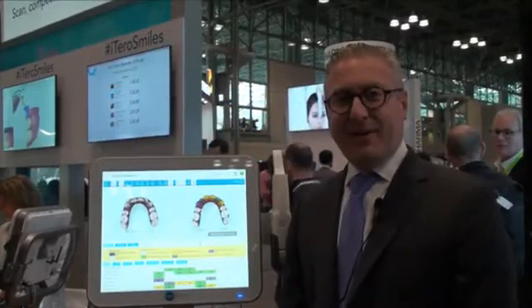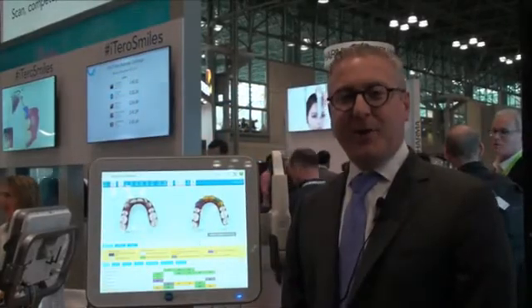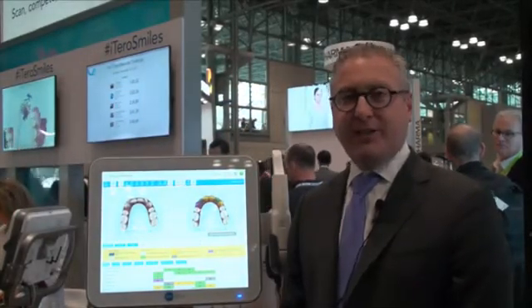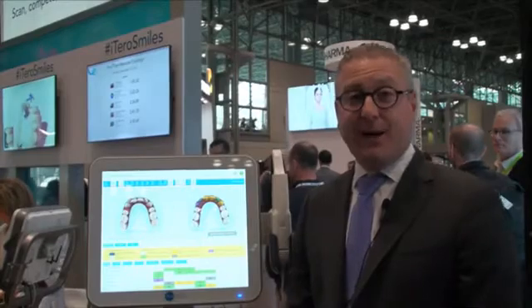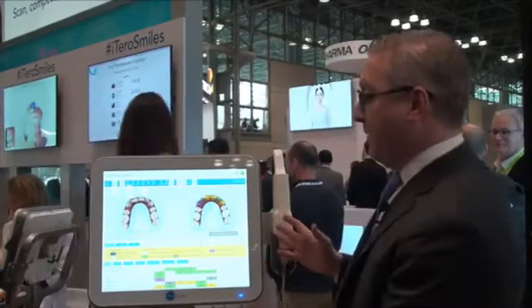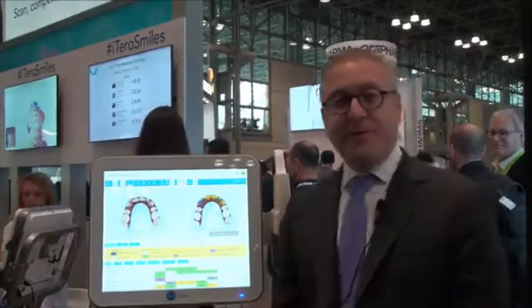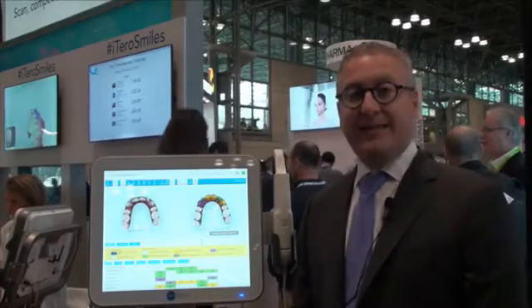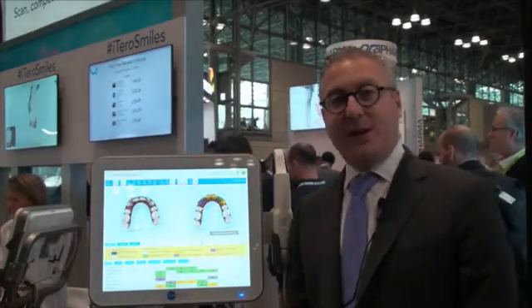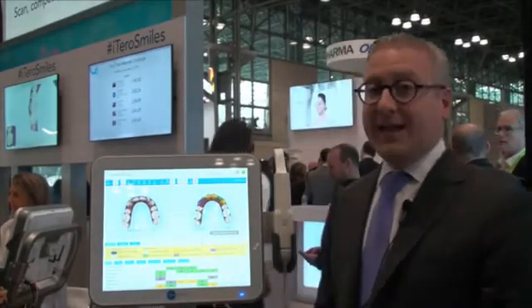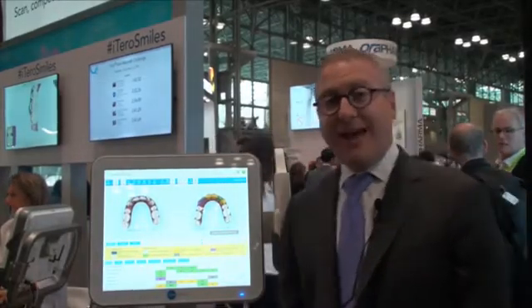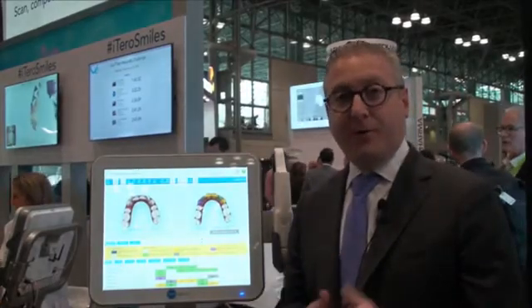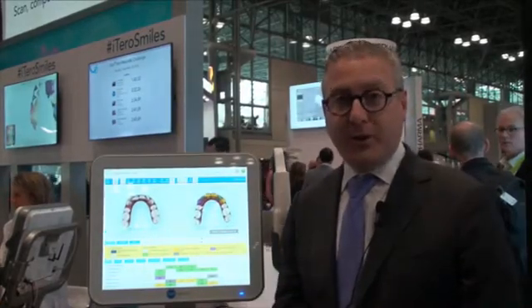Hi, I'm David Galler, and we're here at the Greater New York Dental Meeting. I want to show you some of the new changes that just happened to the iTero Element. This is the iTero Element that's been around for a few years and has been very big in the scanning, Invisalign, and restorative worlds. Just in the last three weeks, they have changed the software and added a few new things I want to show you.